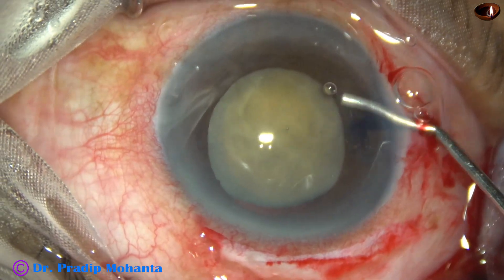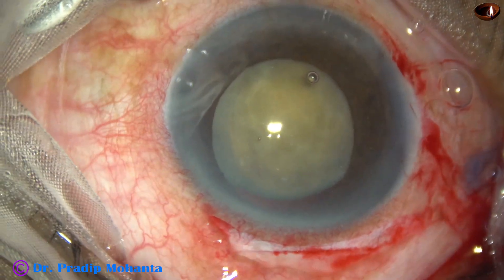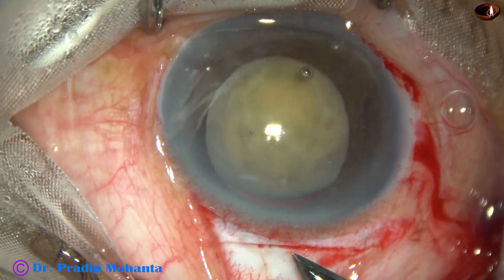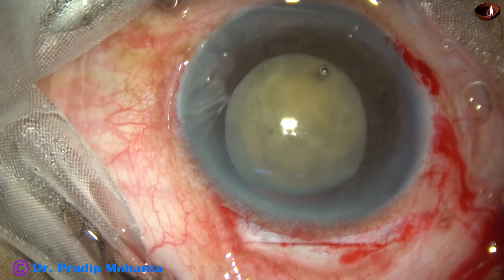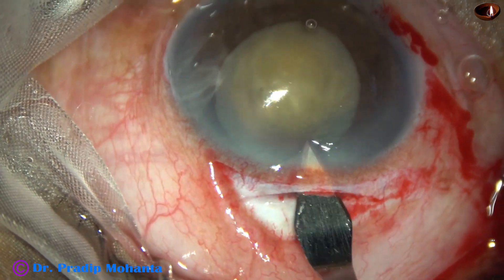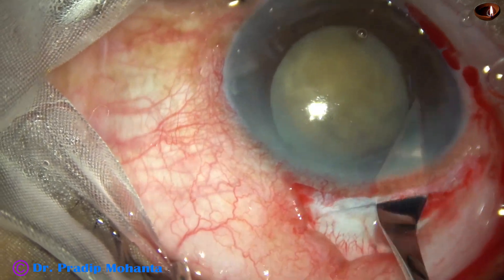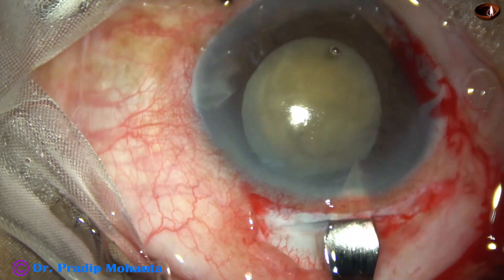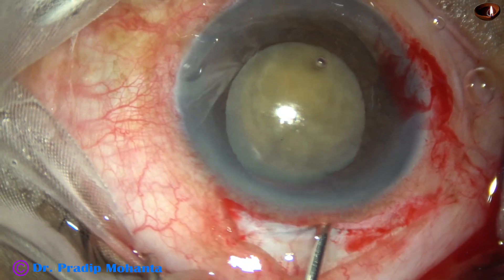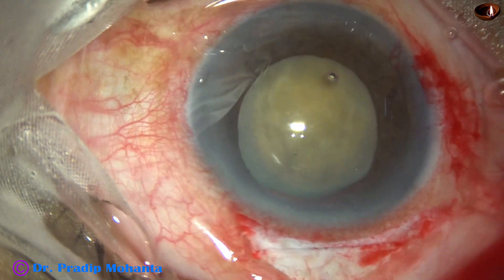Now I have to open the sclerocorneal tunnel. I take the keratome, go to the anterior extreme of the tunnel, and open the tunnel. Now I prolapse the nucleus out of the capsular bag.